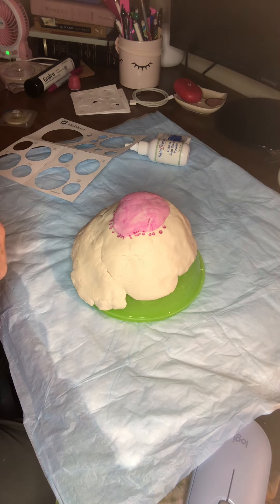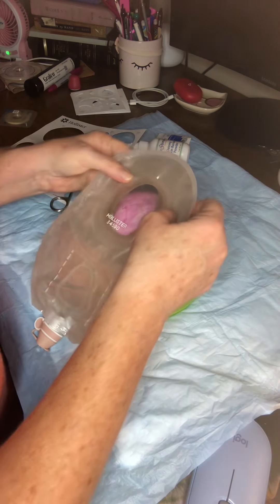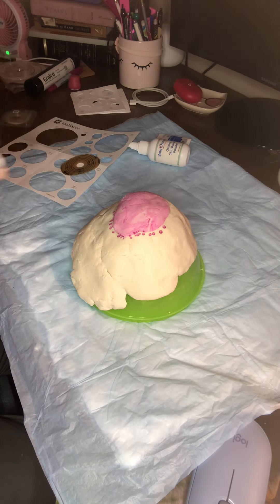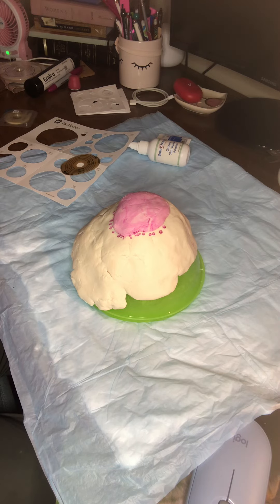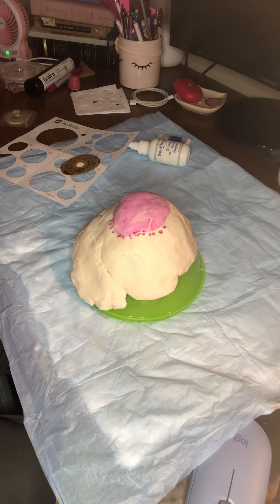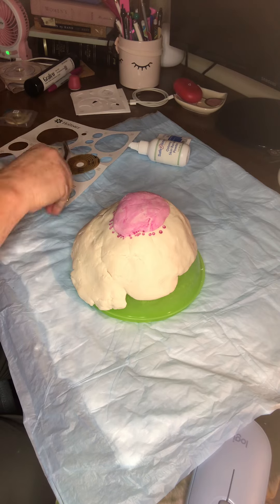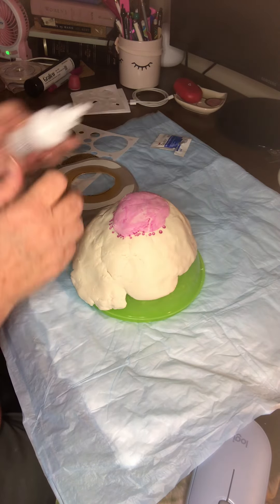I usually try to do a rough cut first and then go back over it to see where I've missed or where I can cut more. That's pretty good — that clears the stoma.